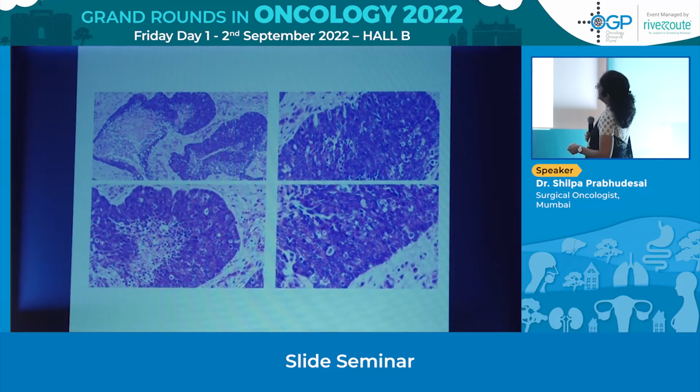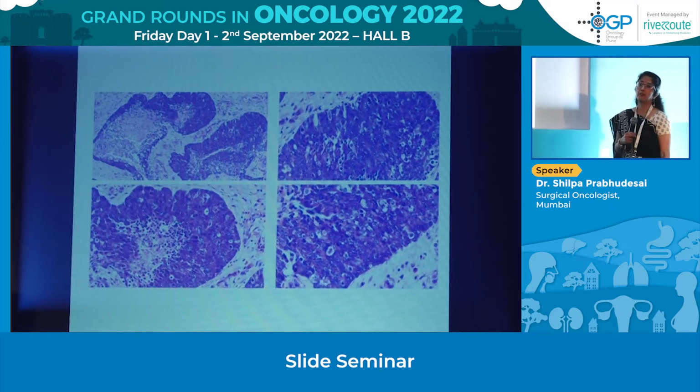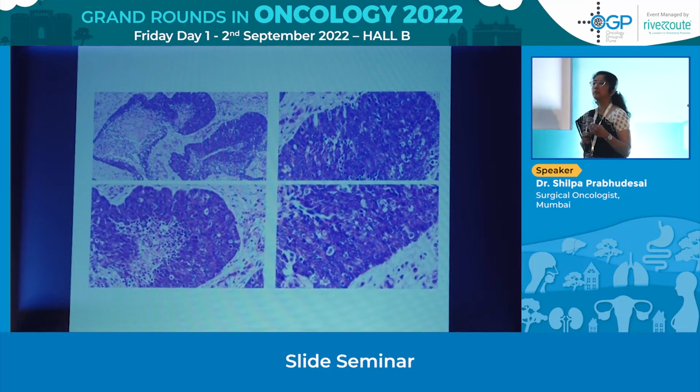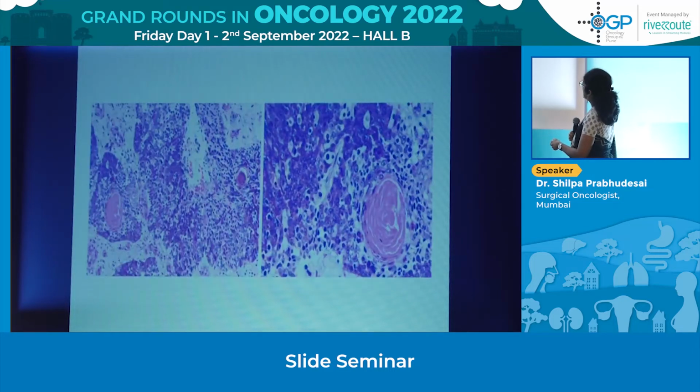So one thinks that okay, this is a carcinoma, and those of you who are familiar with the classification of sinonasal tumors, you know that it gets more and more difficult, because it's not always very easy to classify them without doing extensive IHC. So one can say that this is some kind of a high grade carcinoma. What kind of carcinoma will have to be worked up.